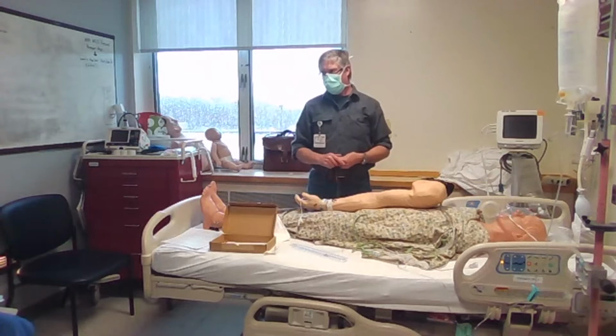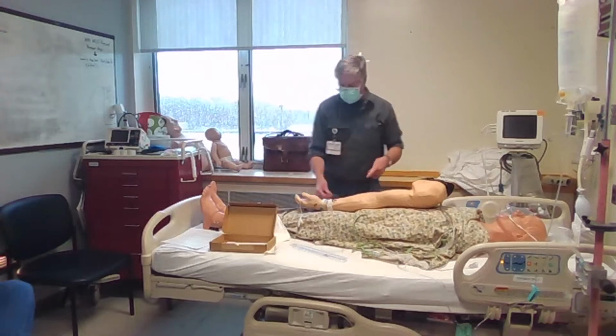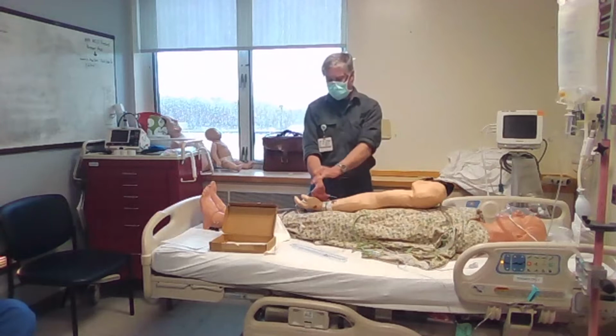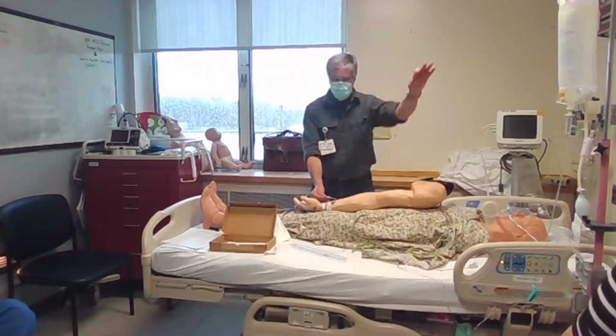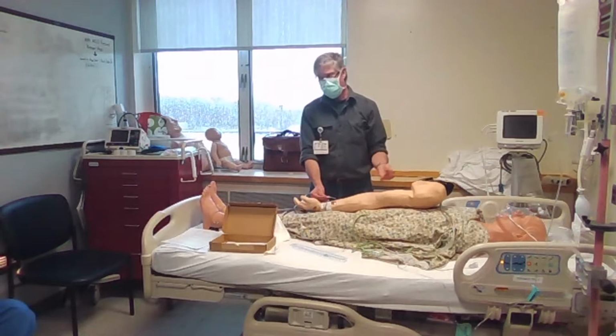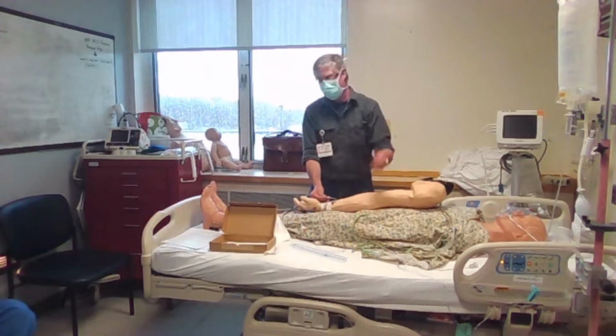Okay, and now what about this leveling situation? We'll talk about that. Right, so there's the occlusive dressing now because you know you've got it, you see it. If you're not getting anything, ask somebody to check all your stopcocks before you let go of it. Because if you didn't get it, you're gonna have to try it again anyway. So don't let go of it, tape it in and have to pull it all off and all that stuff again.